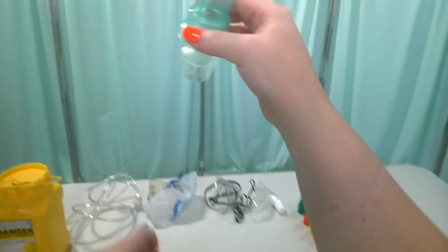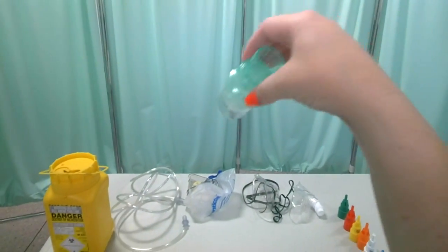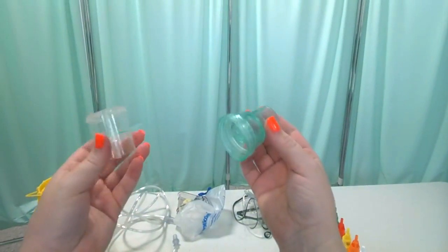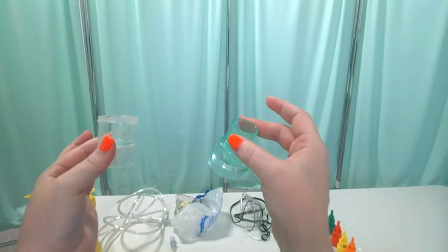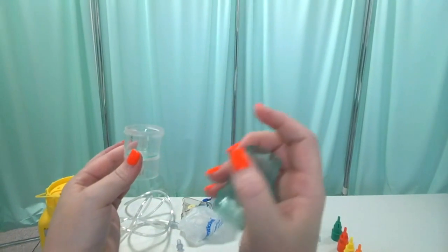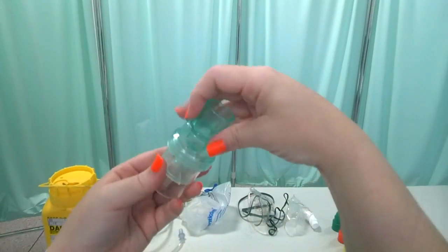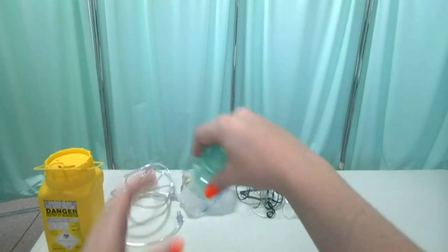Okay, then we've got this second component, which is the nebulizer chamber, or the nebulizer bowl, and it unscrews into two components as well. And this is where our nebulized medication will go. So I'll just do that up for the moment.